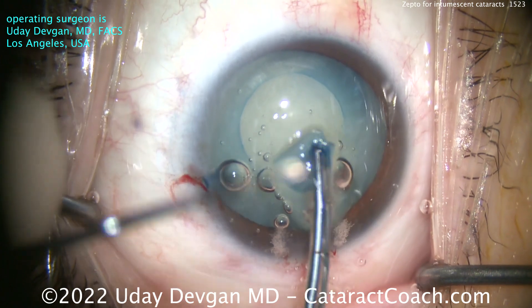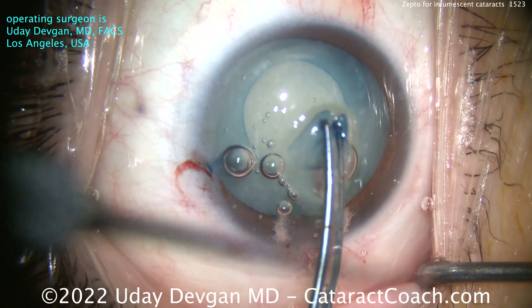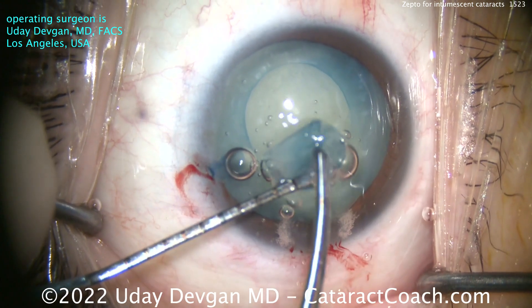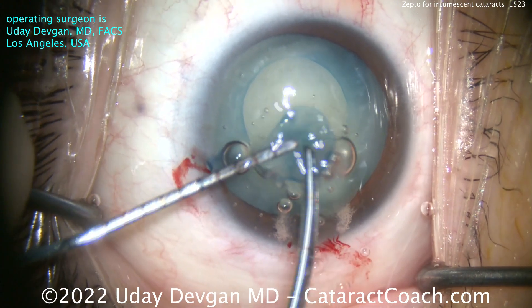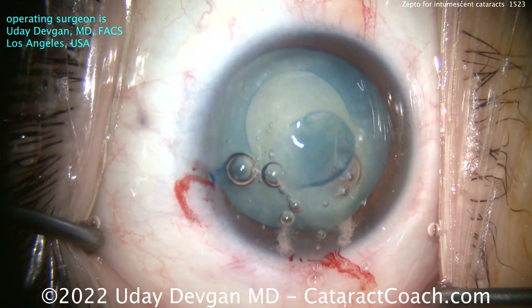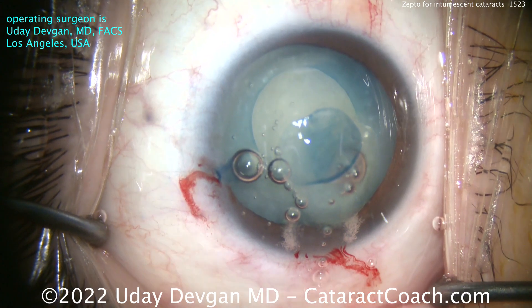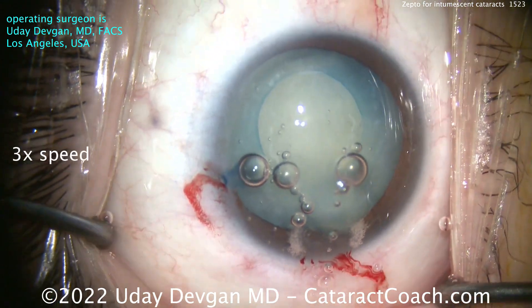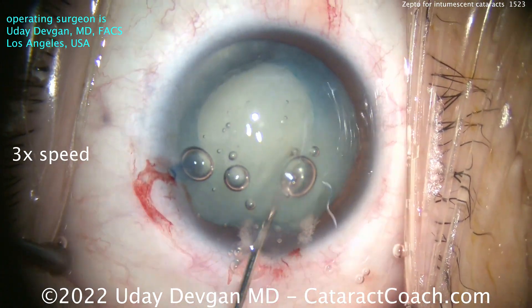So I can take the capsule out of the eye and put it on the cornea — let me show you. It's a perfectly round capsule opening. This capsulotomy is exactly 5.2 millimeters in diameter and exactly centered to where I wanted it. And for a fraction of the cost of a femtosecond laser — really a game-changer and the gold standard for an intumescent white cataract.